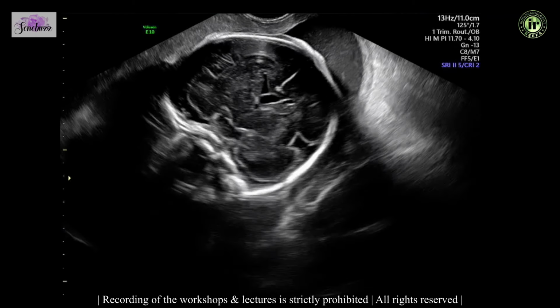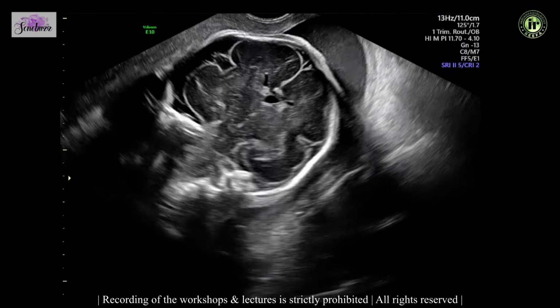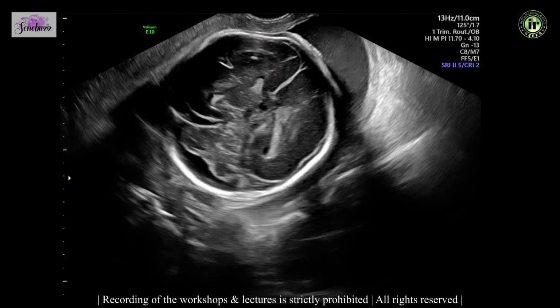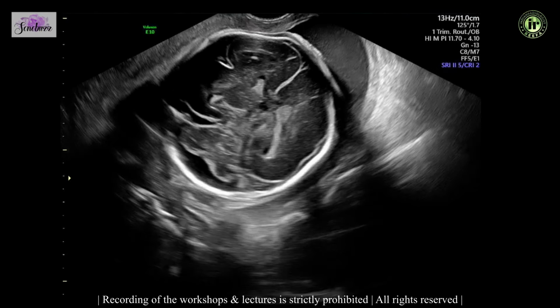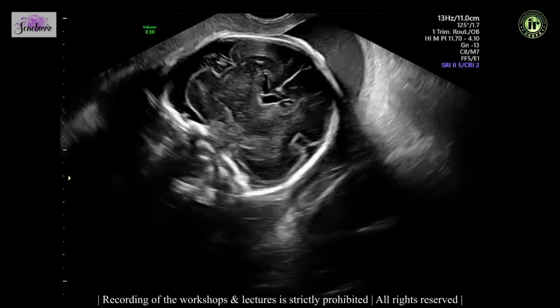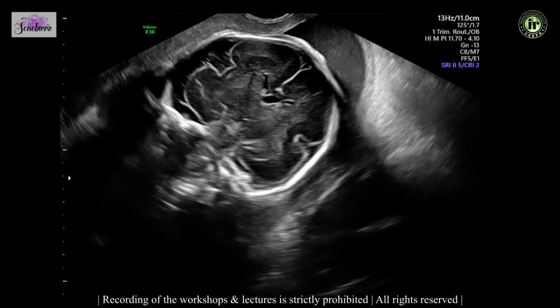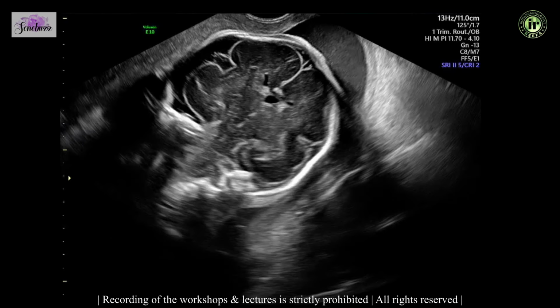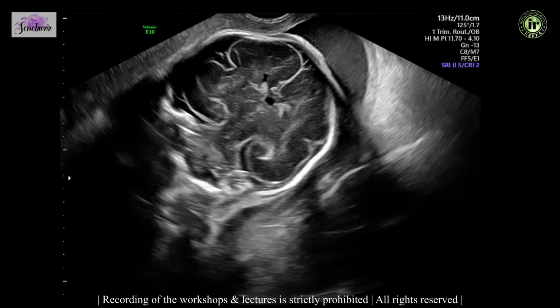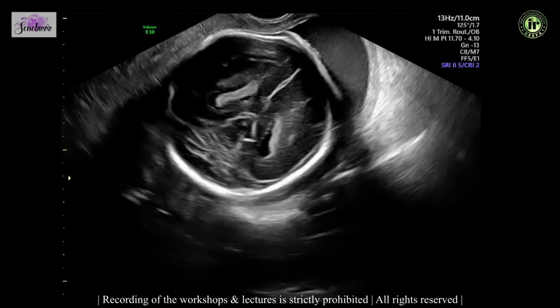Hello friends, today we are going to talk on neurosonogram. As you know, we have a basic neurosonogram and an advanced neurosonogram. Now, in many ways when we scan, we do both the components together, and especially if there is something wrong. Here, of course, we were doing a transvaginal scan because the cervix is completely open, and in that process we are now seeing the fetal brain.